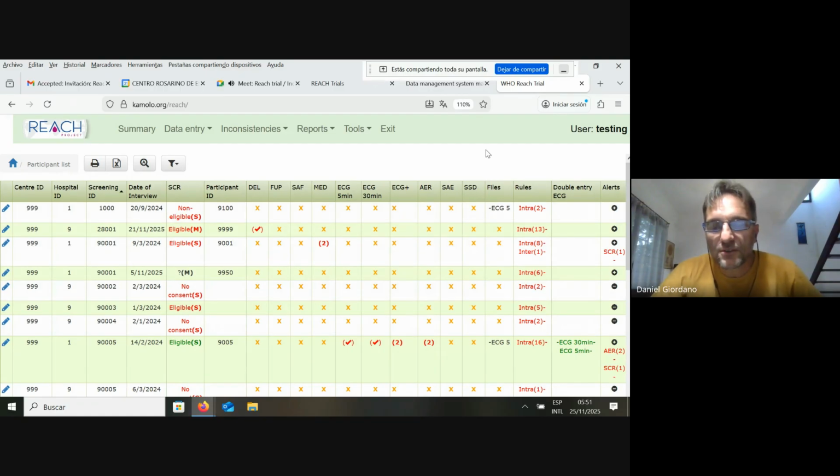Remember that for this trial, you should take a picture of the balance for each of the drapes for postpartum hemorrhage collected, in order to monitor and ensure that each measurement on the scale was taken.